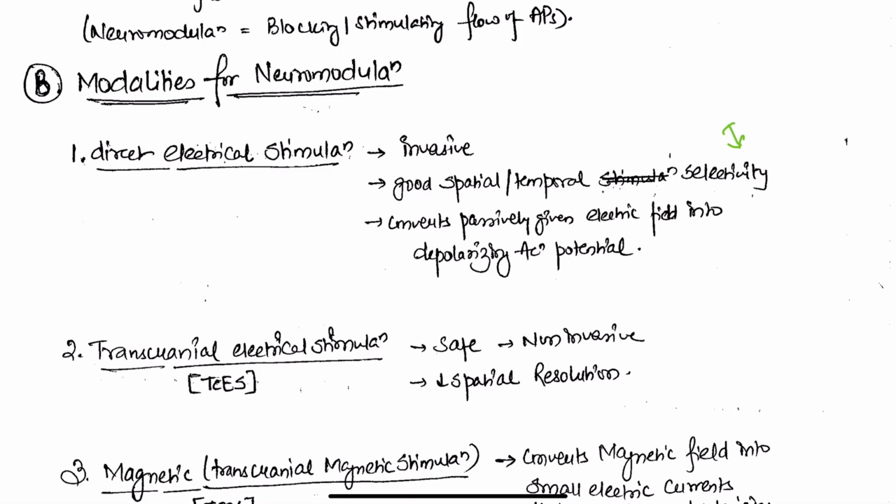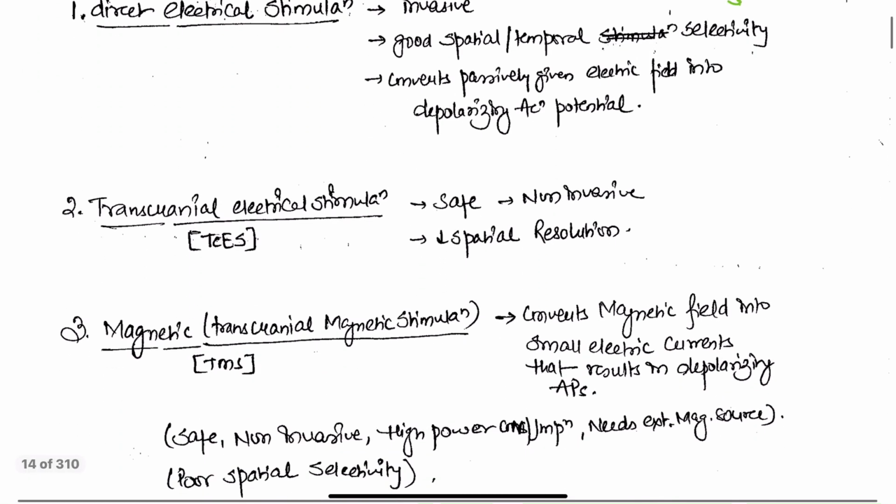So what it is changing is this passively given electric field into a depolarizing action potential. Next is transcranial electrical stimulation. It is safe, non-invasive, and has reduced spatial resolution. So what it basically means is spatial resolution and temporal resolution.